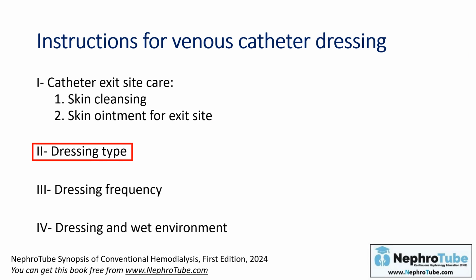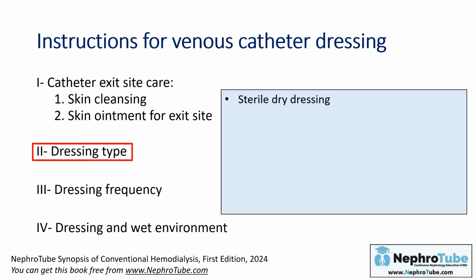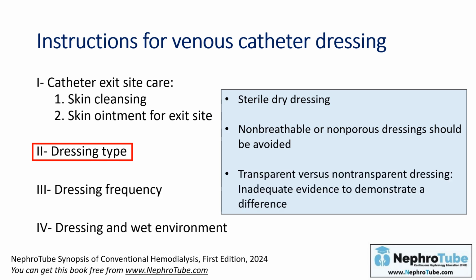Regarding dressing type, which dressing type is better to use? For sure, it must be a sterile dressing. Non-breathable and non-porous dressing should be avoided because this type of dressing carries a higher rate of bacterial colonization. Regarding transparent versus non-transparent dressing, there is inadequate evidence to support either of them. You can use both of them.